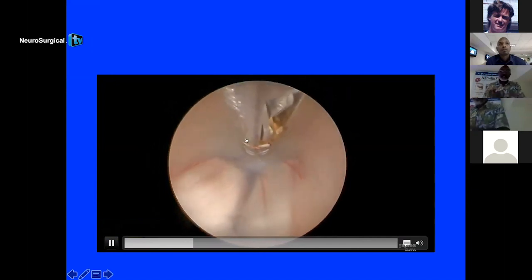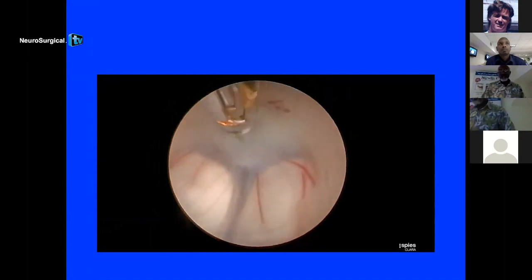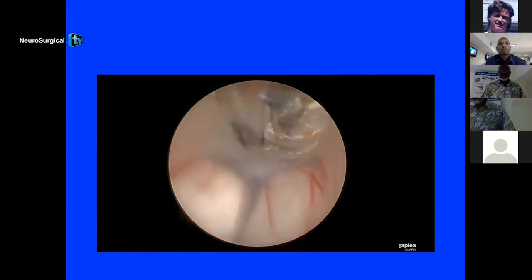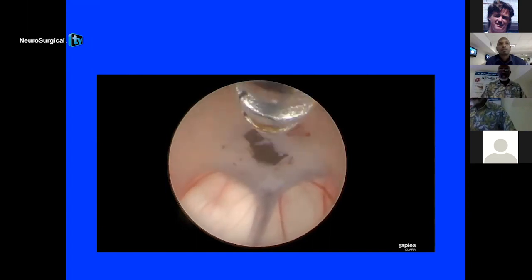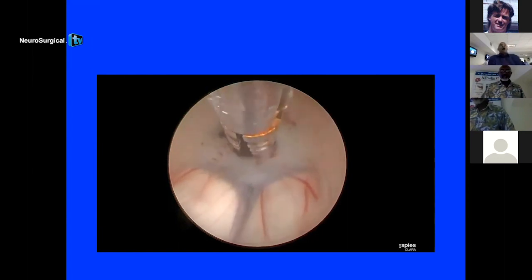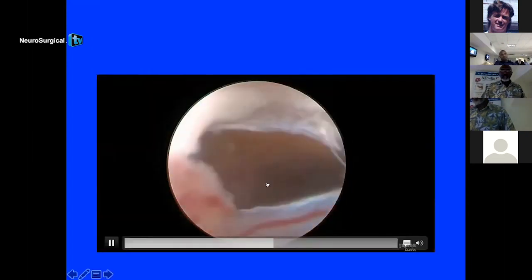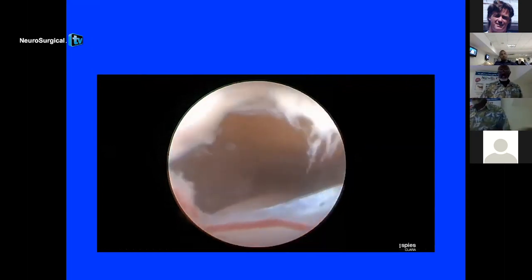And I think this is what was mentioned earlier using the LOTA. Clear. It is rigid, yes. So if it's quite firm, you'll be able to go through. Advanced. And then it can be widened. You need to have an adequate irrigation system going. Zoomed up, you can see well right through up the base. You can see the basilar artery and the pulsations going, and that's what one would like to see.